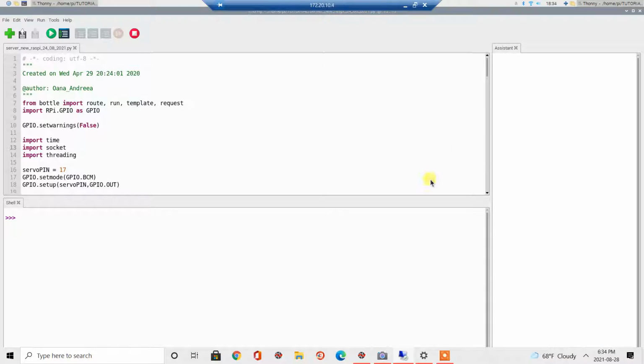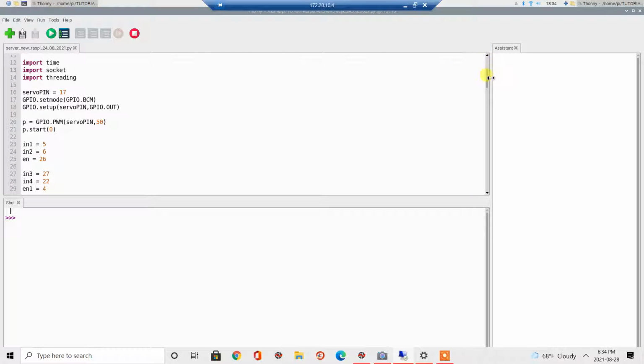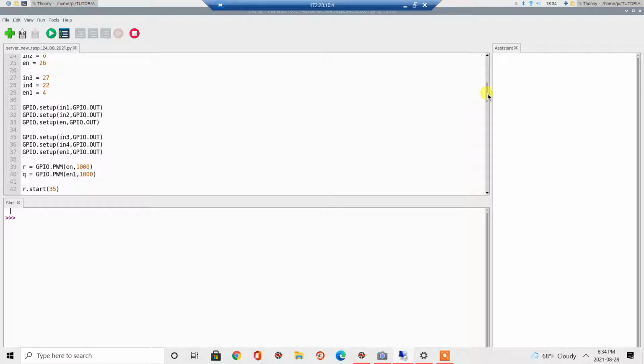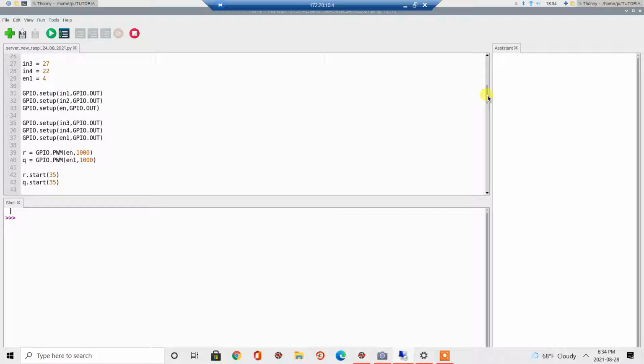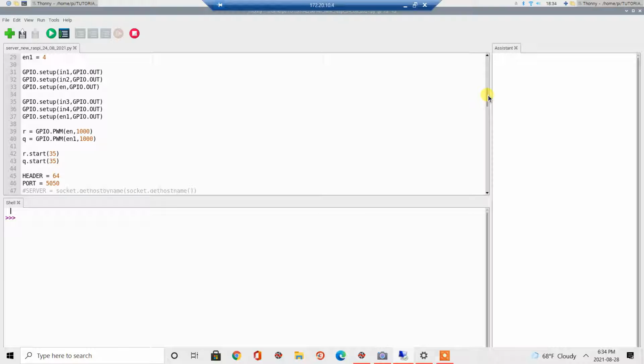This is the Raspberry Pi code. In the beginning, the necessary libraries were imported. Then the necessary lines of code for pin assignments were added. I used output pins.